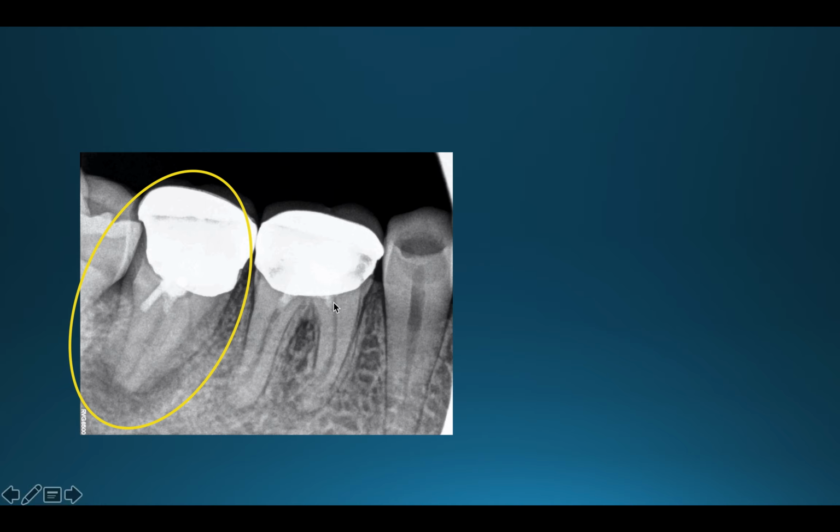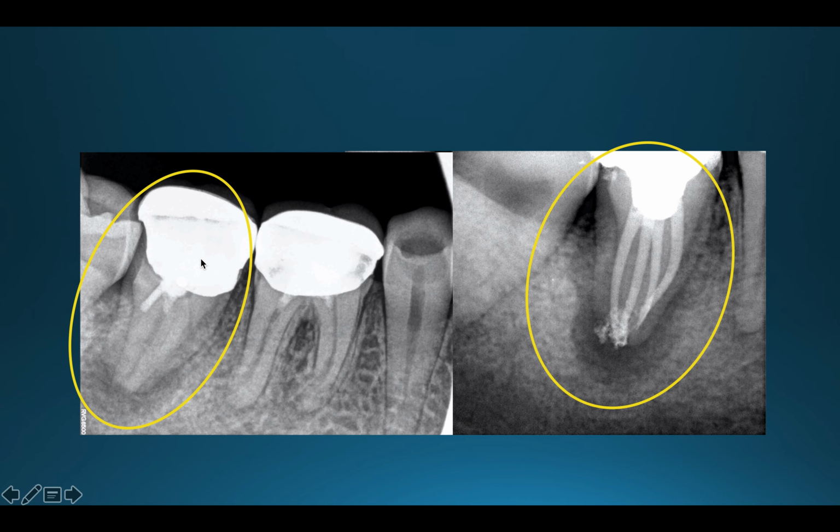If you look at this radiograph on the second molar tooth, you will see that the roots are clearly fused. Compare it to the first molar. In the first molar, you can see the bifurcation area. It's very clear. When we do a root canal treatment, this is how the canals look.